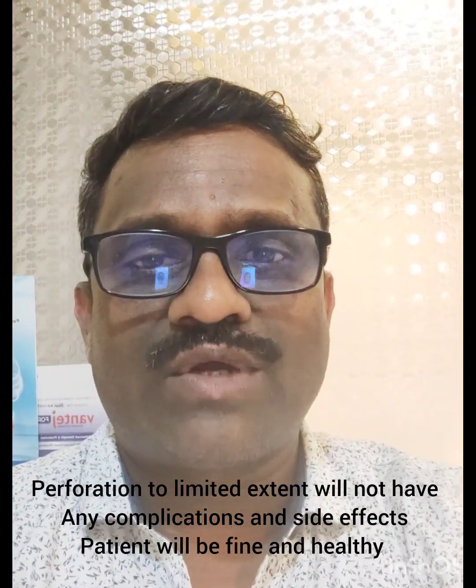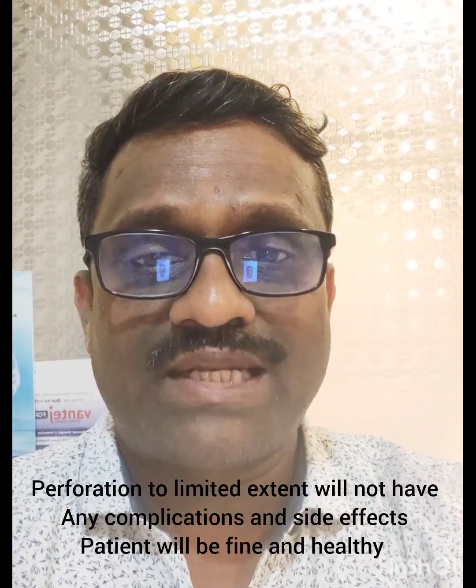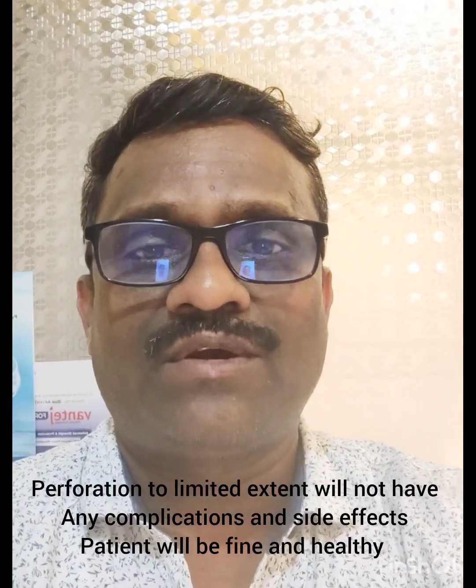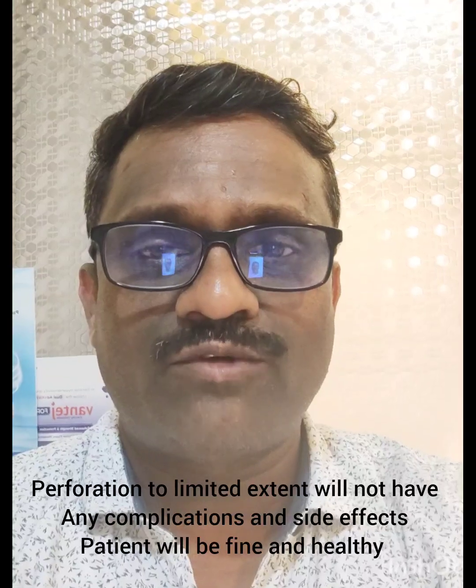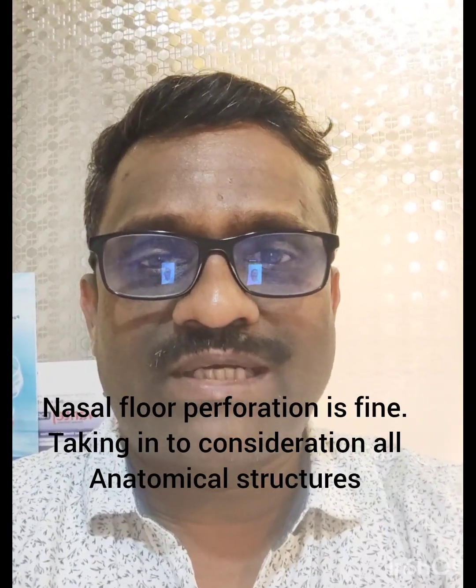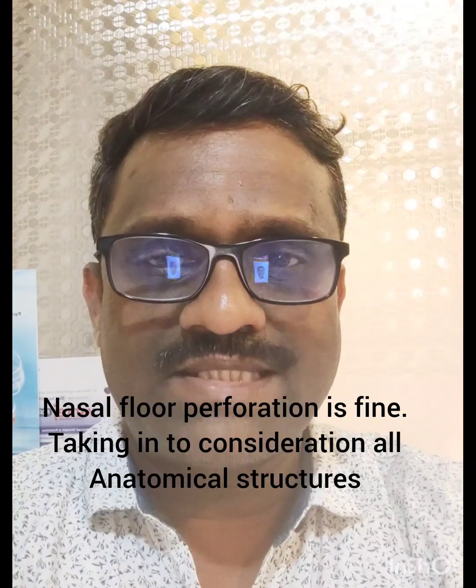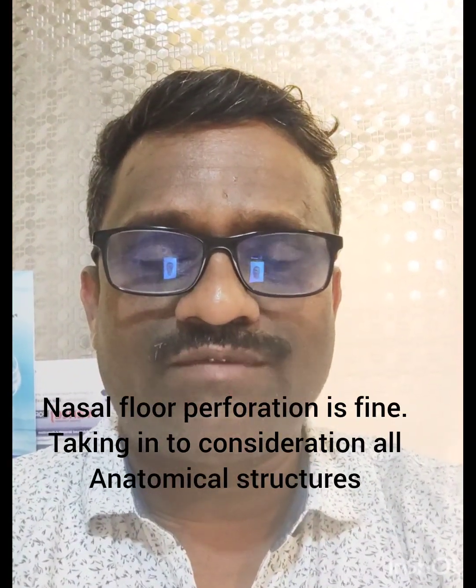So what's going to happen when you penetrate into the nasal floor? Here in the nasal floor we have to engage the cortical bone, that is the D2 bone. So we have to penetrate, perforate the nasal floor. During the perforation, it so happens that the tip of the implant may go into the nasal cavity, that is the floor of the sinus.